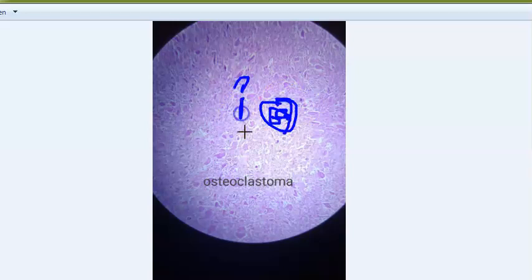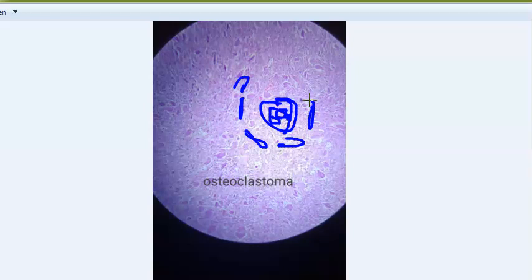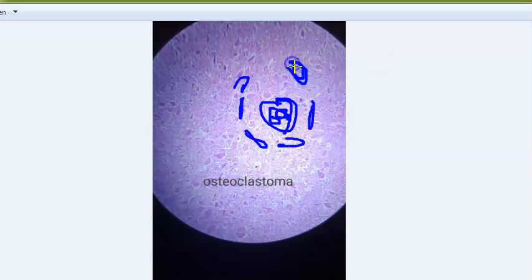The actual neoplastic cells are the stromal cells. These are spindle-shaped to oval cells with vesicular nuclei and indistinct cytoplasmic borders. There will be areas of hemorrhage, necrosis, and hemosiderin pigments. On radiology, you will see a soap bubble appearance.